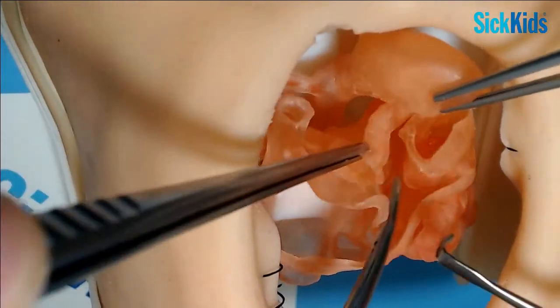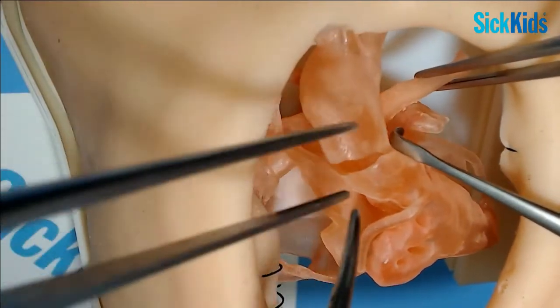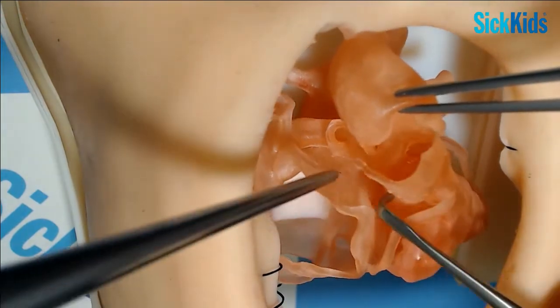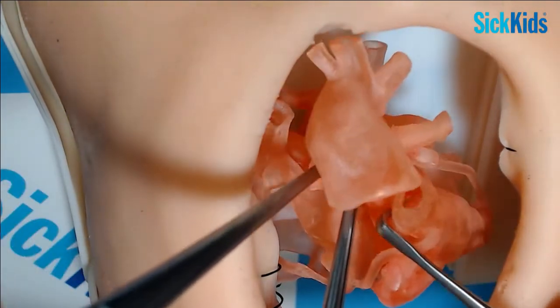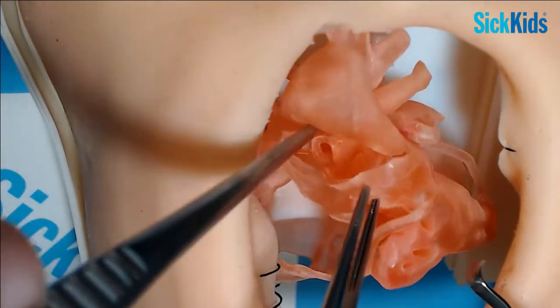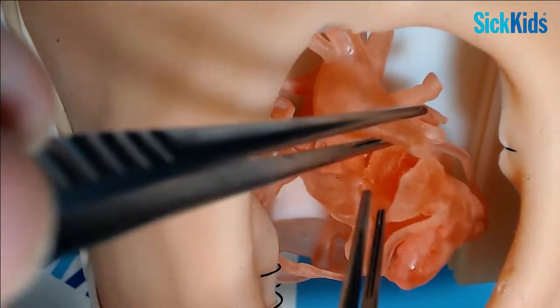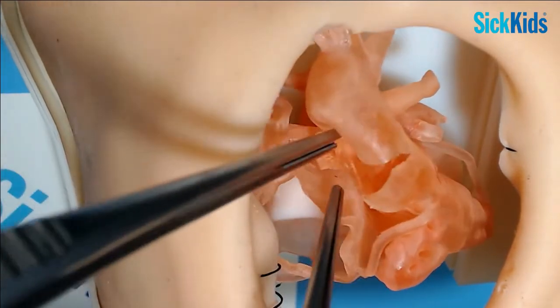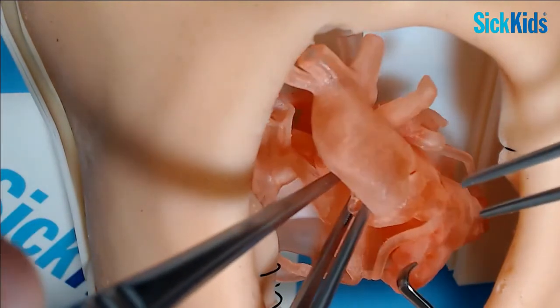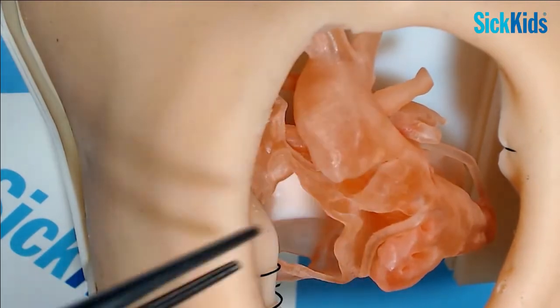Yeah. So now you've got your pulmonary arteries, so that's now nice and free behind the trunk, and you're left with this defect, and you've got to now decide whether you can just close it directly, which you can often do if there's plenty of tissue, or you want to put a little patch in there to repair the defect. And again, all the time making sure you're well above where the coronary ostia might be. And I think with this, particularly because this plastic is a bit less pliable than living tissue, I'd probably put a little patch in there to just replace the defect and then close the front of the trunk.